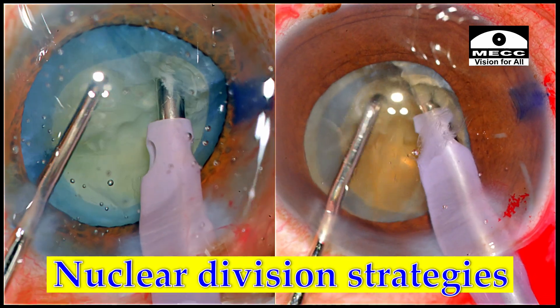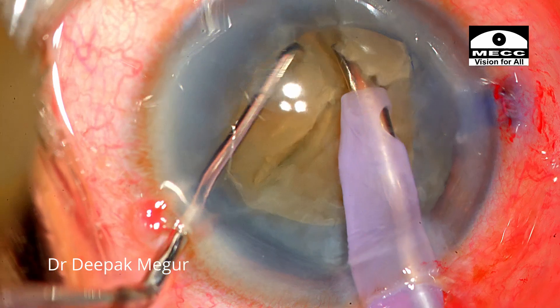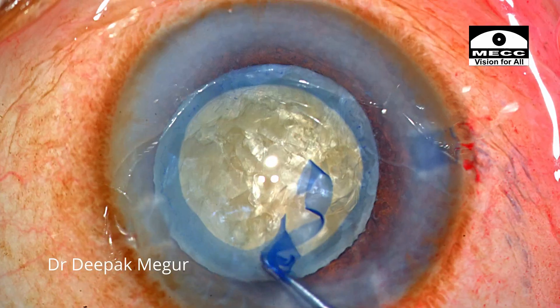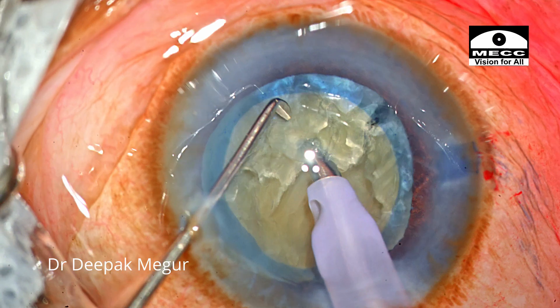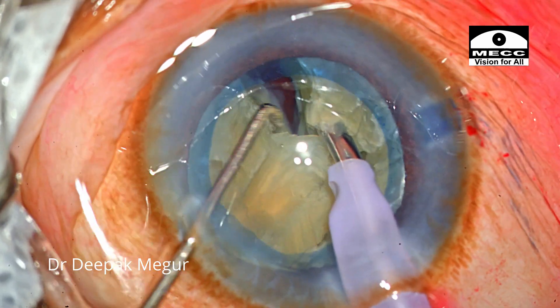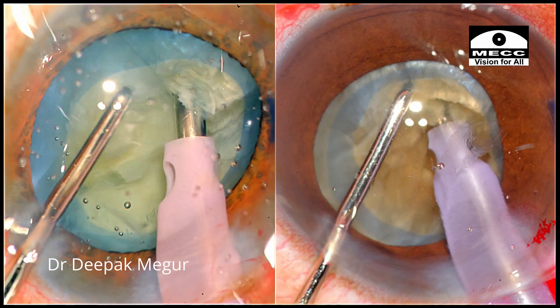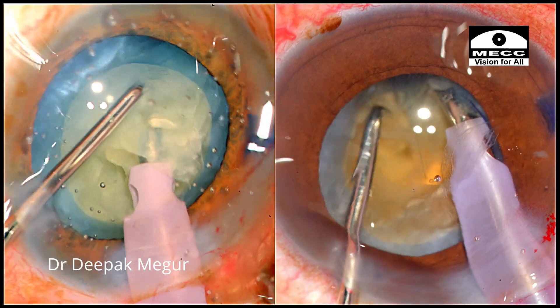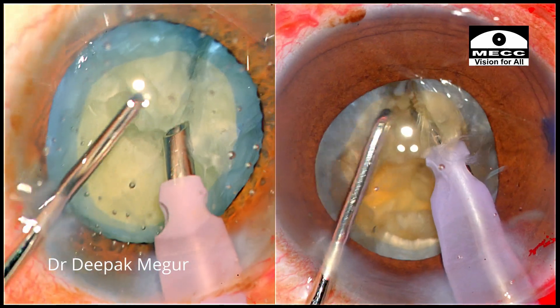Let us discuss the nuclear division strategies when we are dealing with a smaller rhexis. There is always a risk of tearing the rhexis during lateral separation maneuvers, especially while dealing with denser nucleus. In the ideal world, a rhexis of 5.5 mm would be good enough to deal with division of nucleus of most hardness or most grades. But in situations wherein we have a smaller rhexis, let us find out the right strategy to divide the nucleus wherein we won't induce stress on the capsular margins.